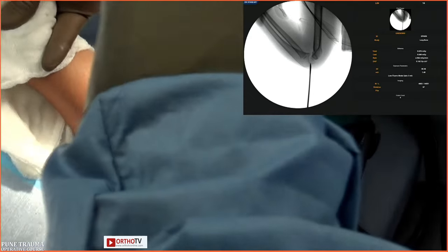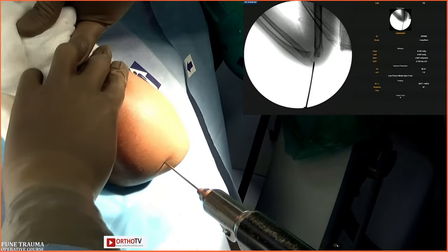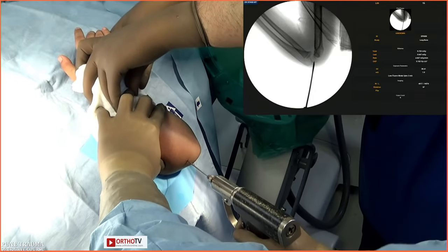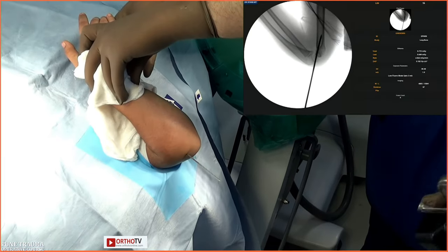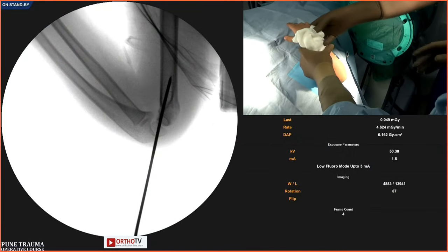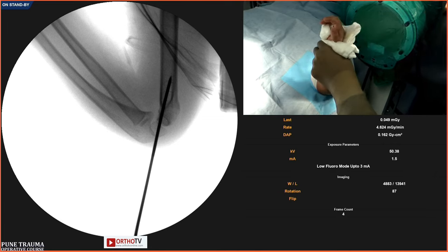Lovely. So Sandeep, what you're doing is basically, before drilling, you are adjusting your positions under C-arm. And then about 60 degrees, I'm aiming towards the medial cortex and I'm going to pass my first pin. Lovely. And I just drive it and I can feel the second cortex now. I've gone across. So for the audience, this is my first pin. This pin is not in the direction of the axis of the humerus shaft. It is going anterior to posterior because the distal humerus also is tilted that way. Now we go to AP and we check.